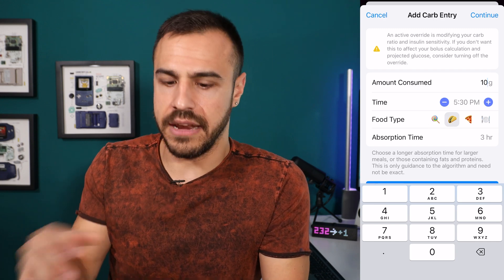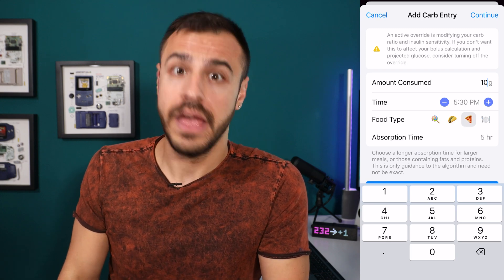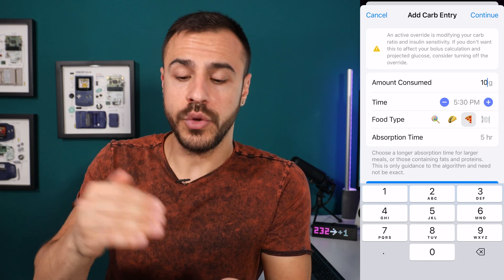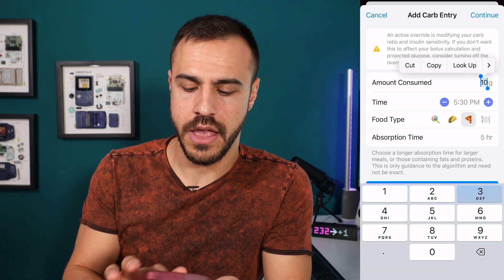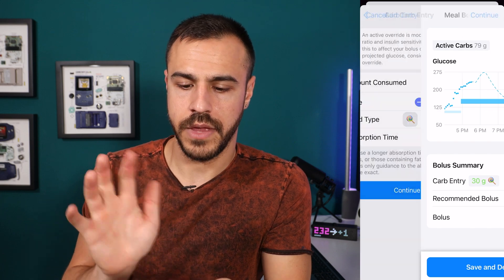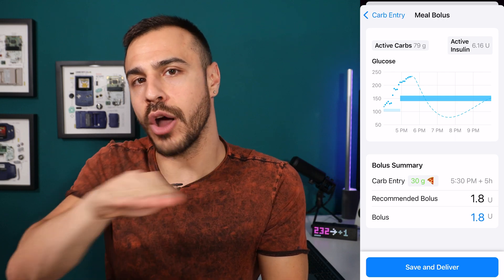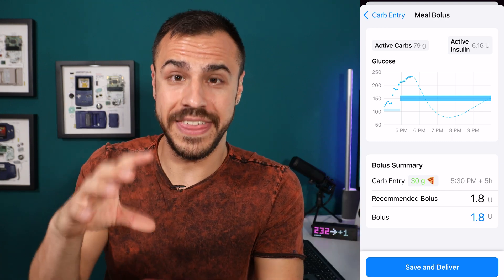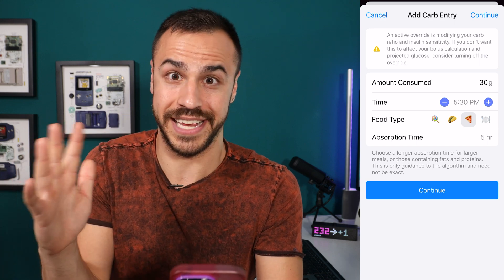Then you go to the taco — that's three hours, which covers most foods that hit your blood sugar over three hours. Then there's the pizza — many of us know how pizza and other very fatty foods like a cheeseburger and french fries work. That's five hours of absorption time. What these are doing is creating an extended bolus in the algorithm for you. For example, 30 grams of carbs with the lollipop gives 2.2 units, but the same carbs with pizza only gives 1.8 units — because the pizza is going to take longer to affect you, and the lollipop is going to hit you faster, so you want to get insulin faster. That's how incredible this app is.